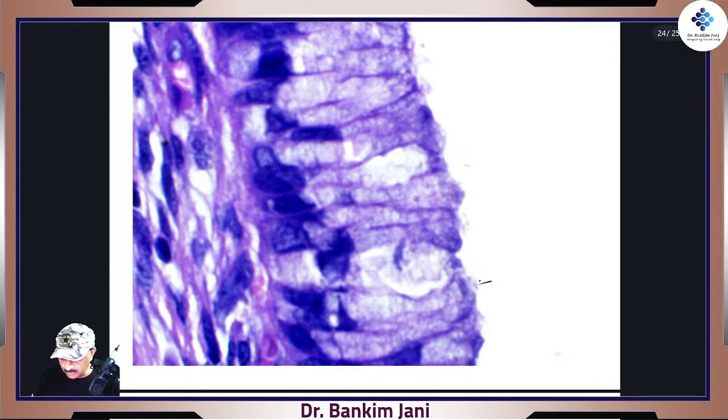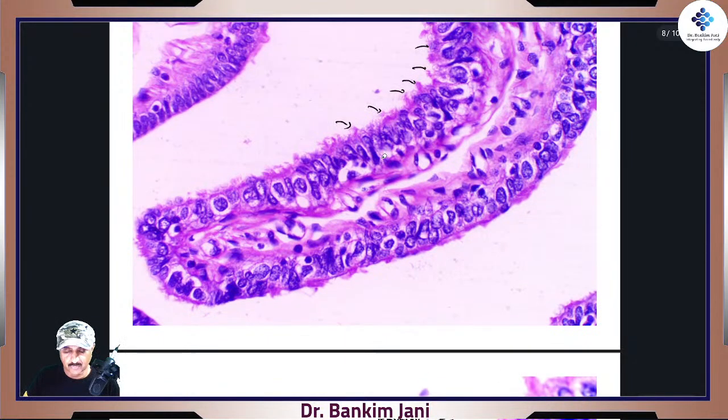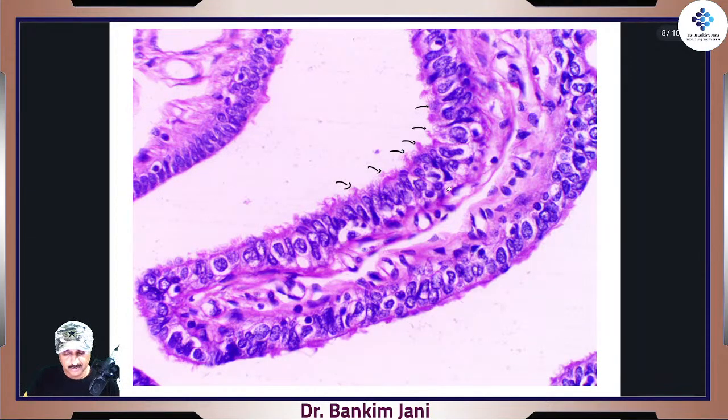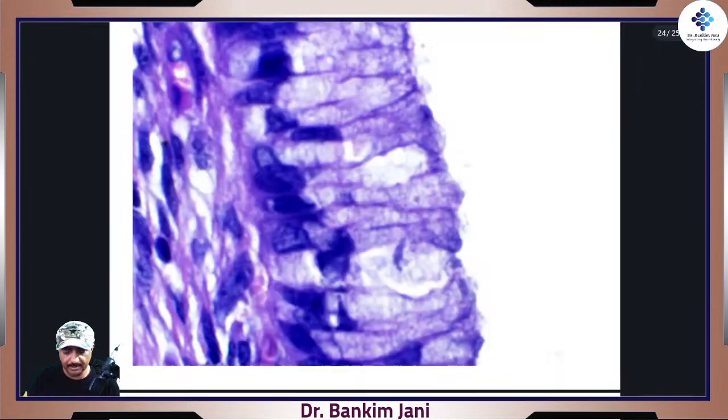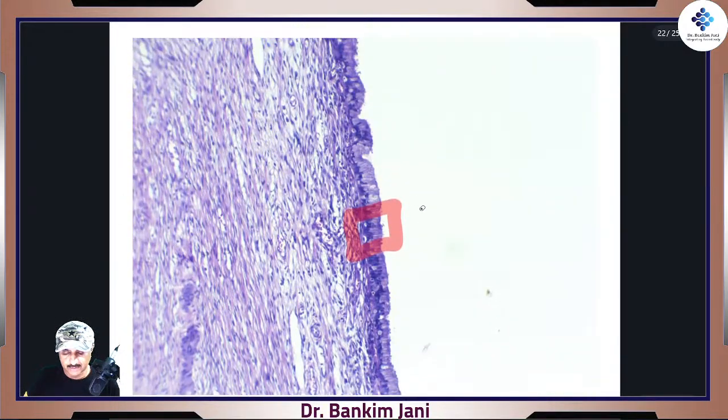And what you are watching over here, these minor things, are just stains, some soft tissues which slightly come out, but not cilia. Cilia are totally different. Watch this and compare it with this. Even over here, see the border, how rough it is. And over here, if you zoom, see how smooth it is, non-ciliated. Watch this, how smooth it is. Got it?